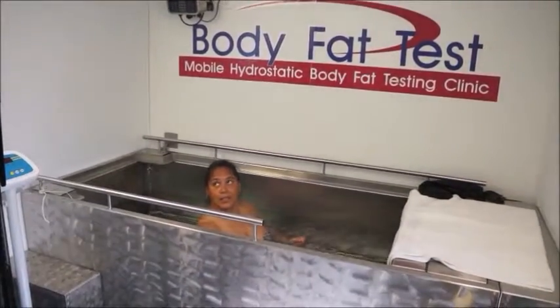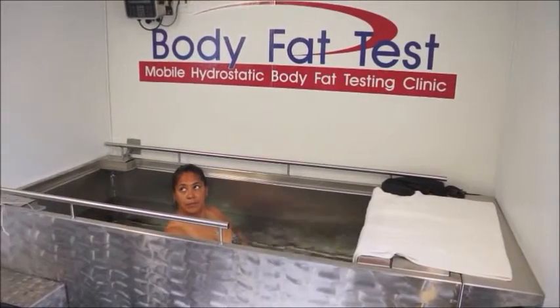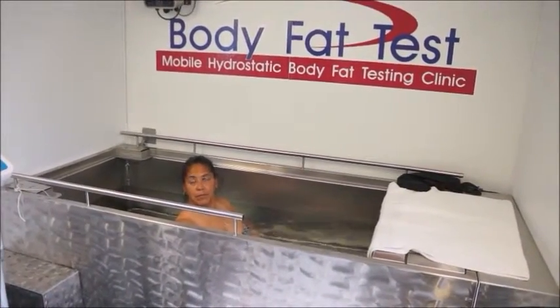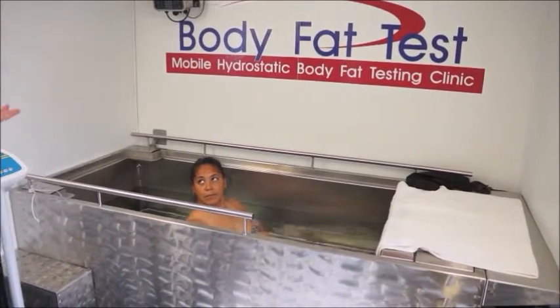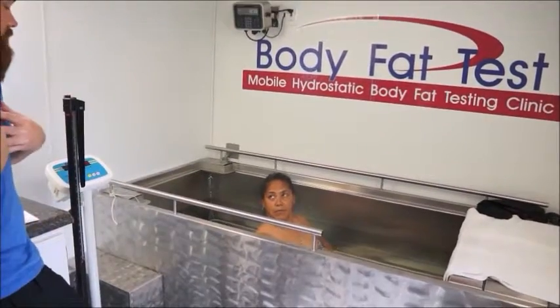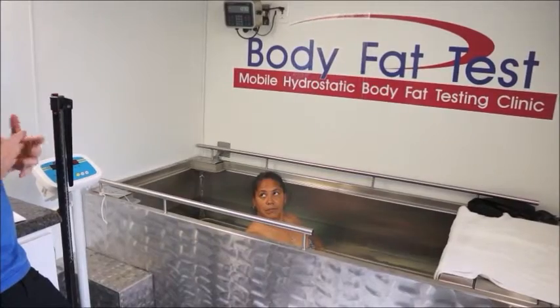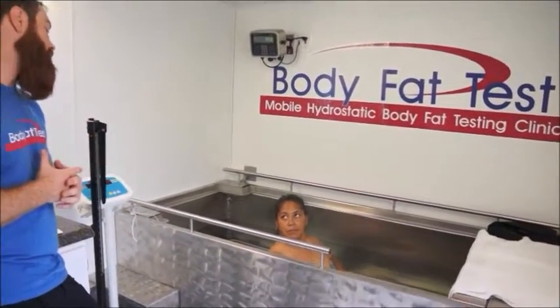What we're doing here is getting your weight underwater. The whole idea behind this is that your lean body mass is going to fall to the bottom, making it heavy on the scale — which is a good thing. However, your fat is going to be floating to the top, making you lighter on the scale. In this test, air equals fat. So we need to eliminate all the air.